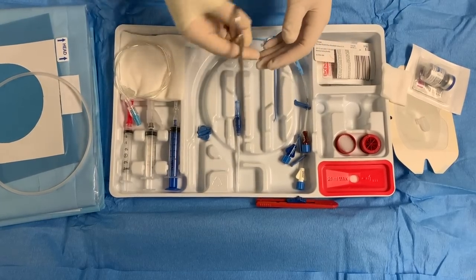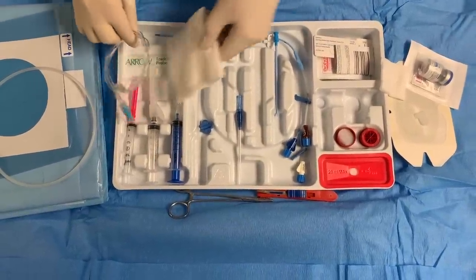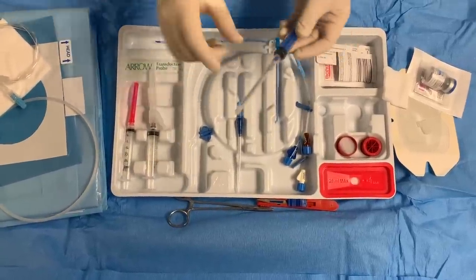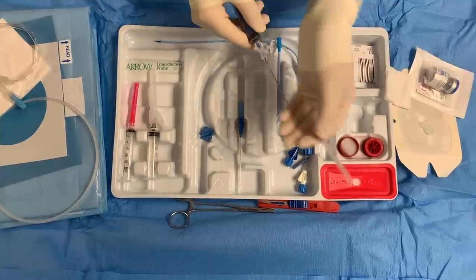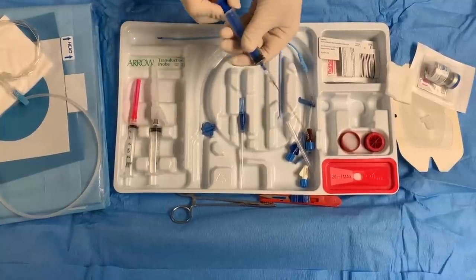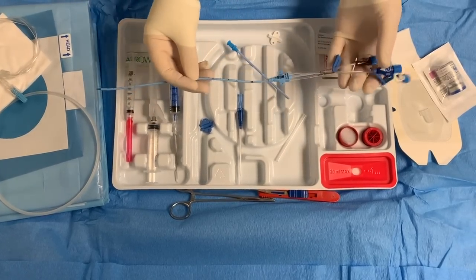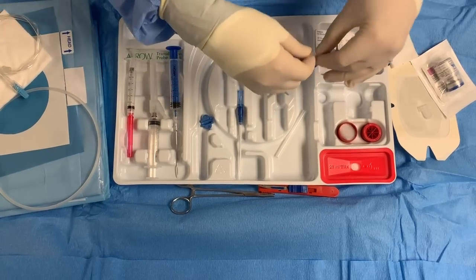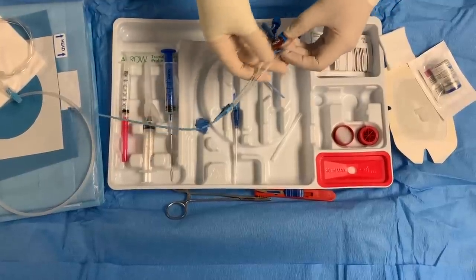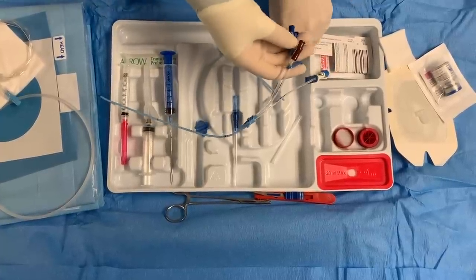This is going to be your needle driver — make sure it works. You move this stuff; a lot of them you don't need to use. This is going to be your needle. Move this out. The bevel is going to be always facing up. You want to make sure you can aspirate. This is going to be our triple lumen catheter. Open all these up.